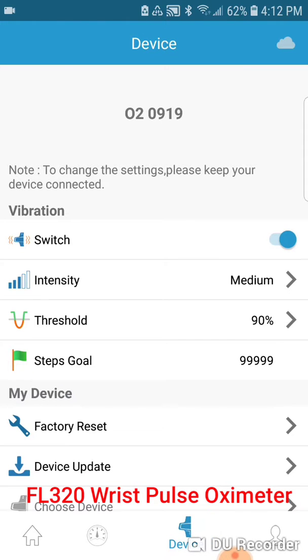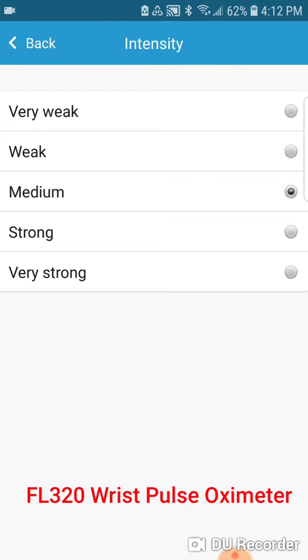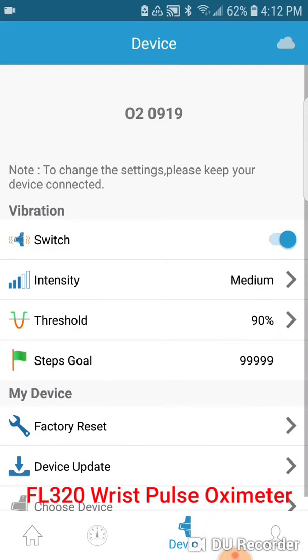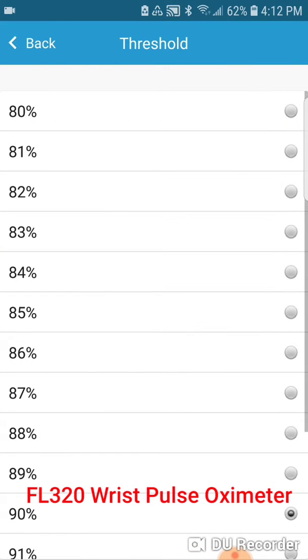The other option is the device, which will give you several other options such as intensity, which can be changed from very weak to very strong, as well as a threshold setting for your SPO2 percentage.